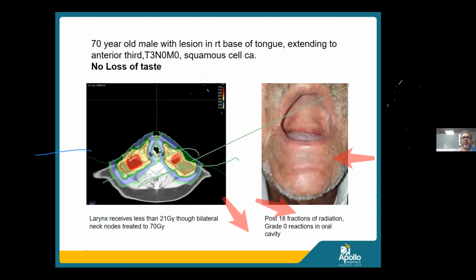The data for the thyroid and the larynx is a bit iffy, although some work is going on because there is motion management. You can achieve equally good results perhaps with photon, but that data is not so robust. But all other sites, head and neck cancer has become very good.